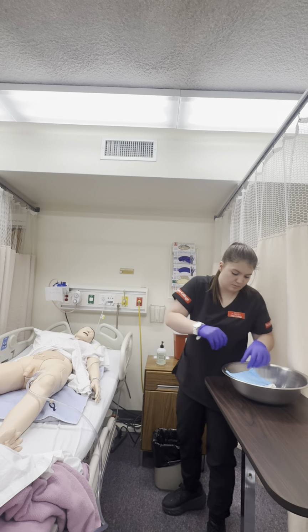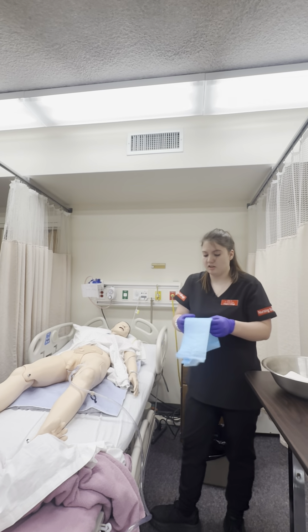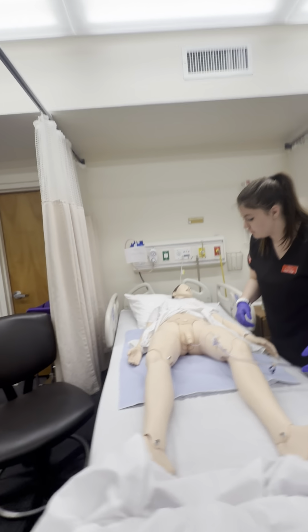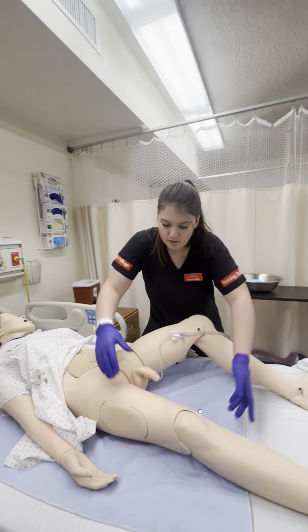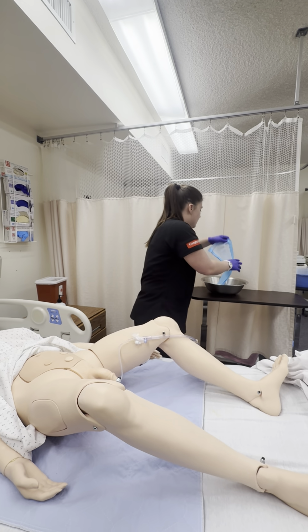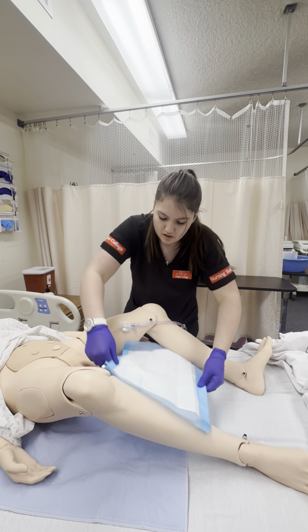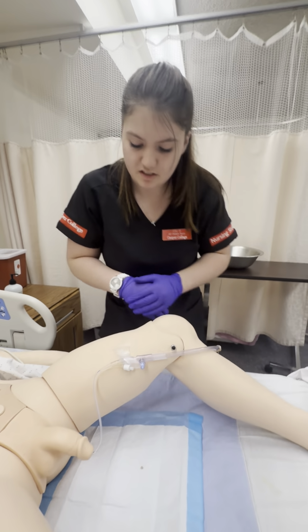Okay, I'm going to use my disposable chucks, and I'm going to place these just underneath the patient's hips. All right, do you mind if I just adjust your position a little bit? Yeah, sure. Okay, I'm just going to lift your legs up, just so we can get some chucks under there. Looks like we have some chucks already under there, so for the discontinuation, I'm just going to put these disposable ones under you just for some easy cleanup.